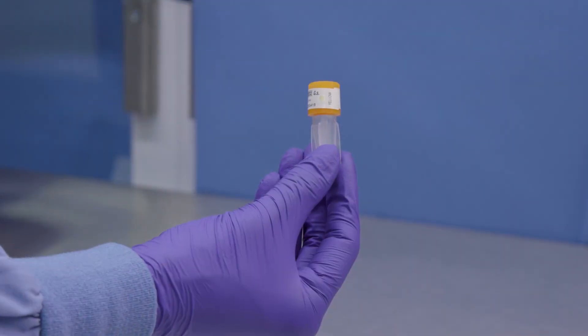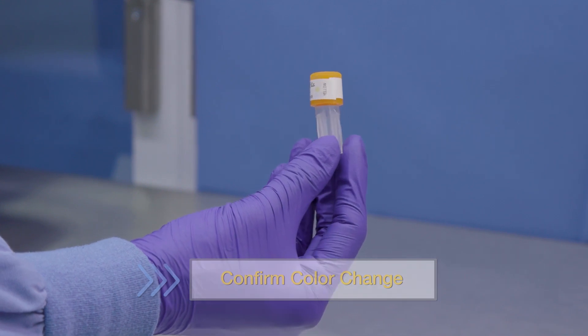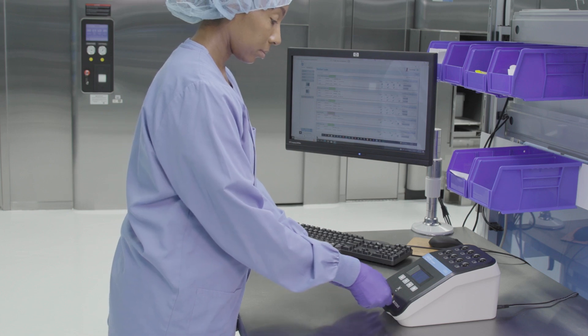Next, remove the BI from the pouch and confirm the process indicator color change from magenta to orange-yellow, indicating exposure to vaporized hydrogen peroxide.